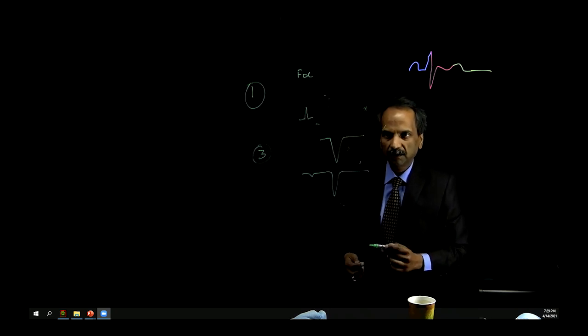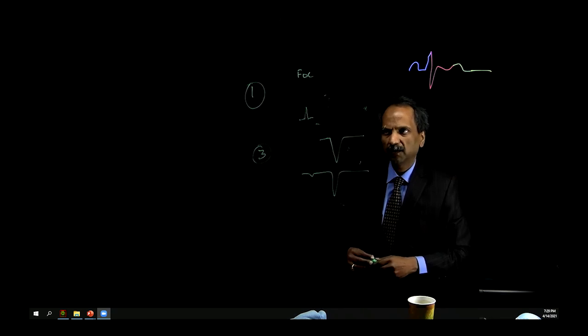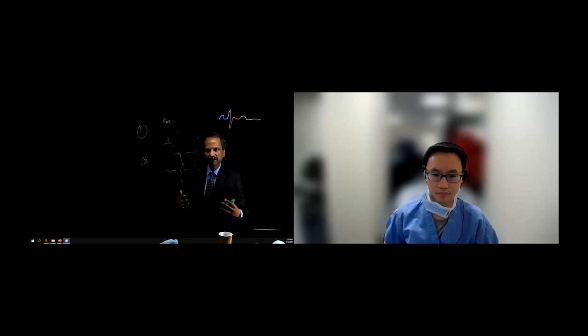So maybe I'll get thoughts from Dr. Lee again. Why would this be, Dr. Lee? Why would it be that the unipolar signal is actually later than the bipolar signal? Bipolar signal were right there. It should give us this QS complex.